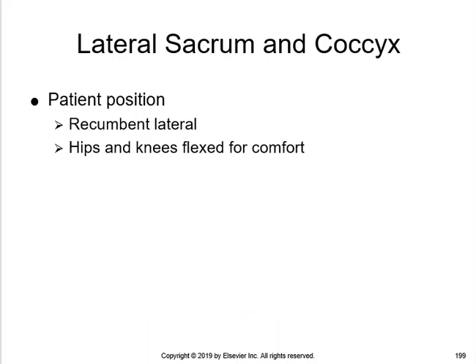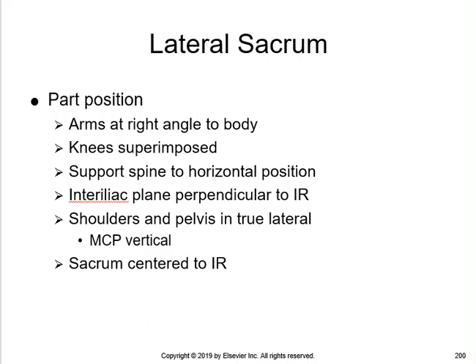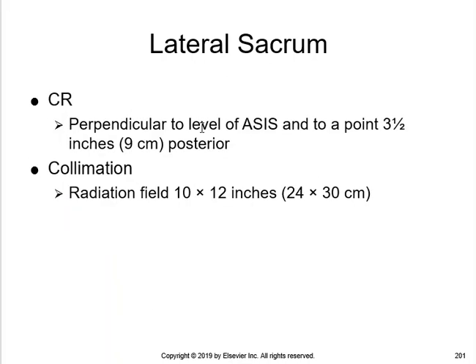On the lateral, you're going to position the patient just like you would the lateral for the chest, or for the T-spine, for the L-spine, L5S1 spot, and that is to put the patient in a true lateral position, arms out in front of them, knees superimposed, pelvis perpendicular, the femoral heads stacked on top of each other. So good lateral position.